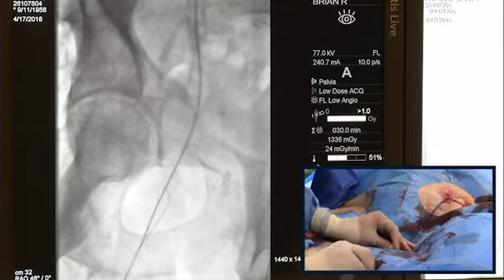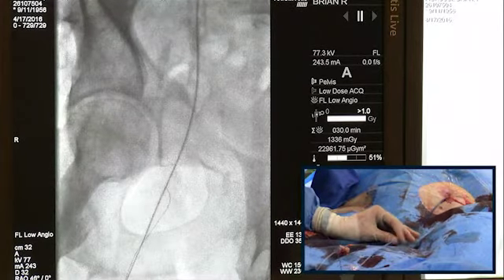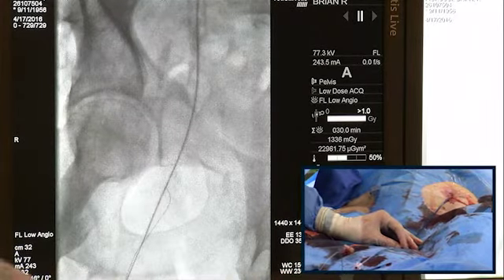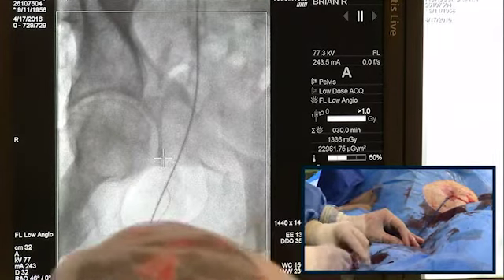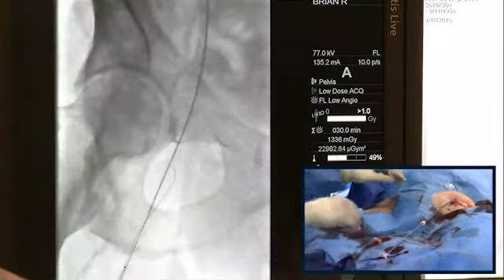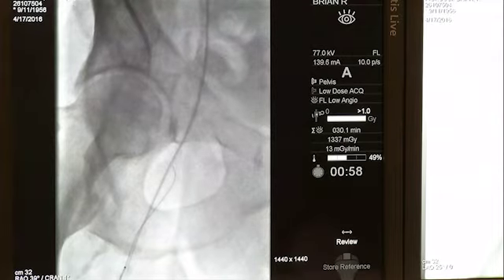Okay, good job. So that was the technique, I guess. In this situation, the multi-purpose helped us. So I think we crossed it now. Let's see what we want to do here for a second. Let me come over here. I'm going to bring this multi-purpose down a little bit, and I'm going to see if I can wire it with this wire here.